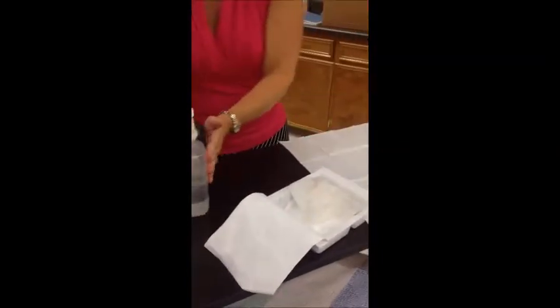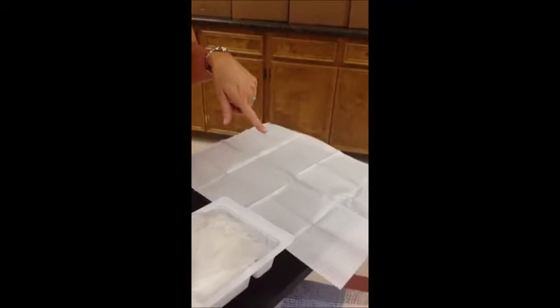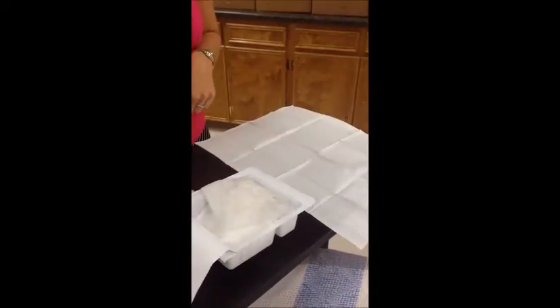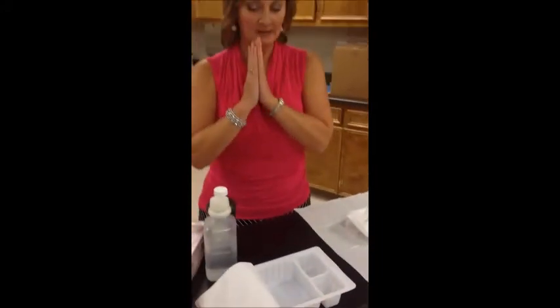The next step is to take the contents of this container and dump them onto this sterile field. You need to be careful of your 1-inch edge that is considered contaminated. So very gently dump your contents onto there and lay this to the side. My hands are still just my hands, no gloves yet.